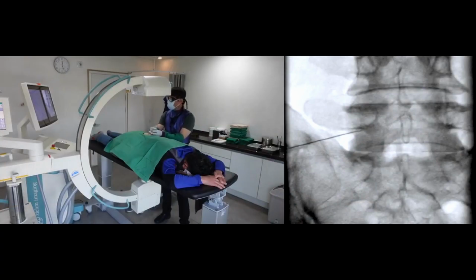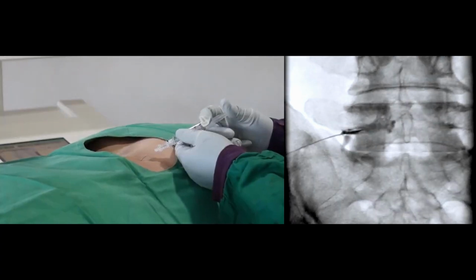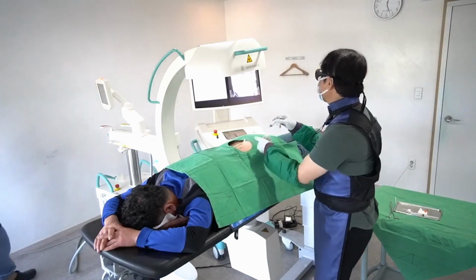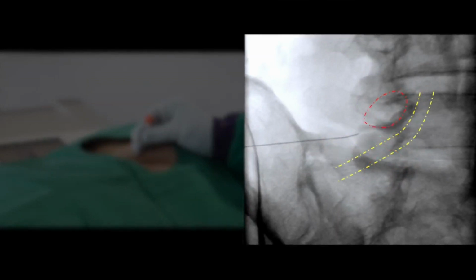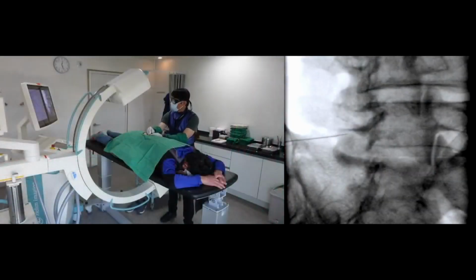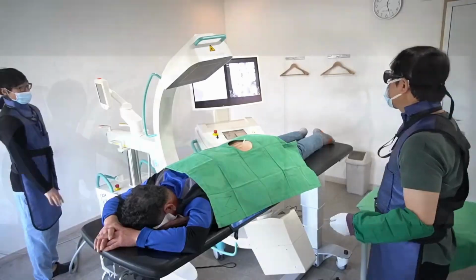On the AP view, this triangle seems like a safe triangle. I will proceed with advancing the needle while under contralateral oblique image guidance. Please monitor the needle tip. Following this, I will revert to the AP view. If positioned correctly, the needle tip should reside within the safe triangle. When the needle is placed correctly, the contrast will spread to the transforaminal and epidural space. Please keep this image in mind when reviewing the contralateral oblique image.